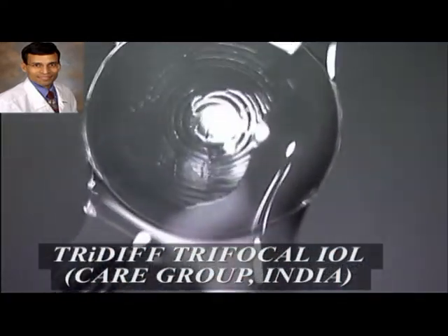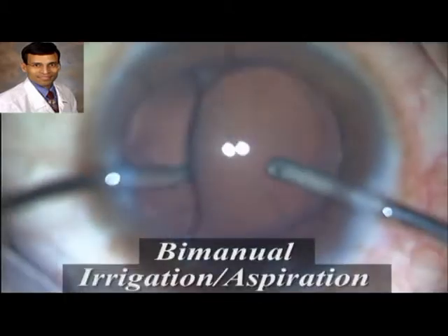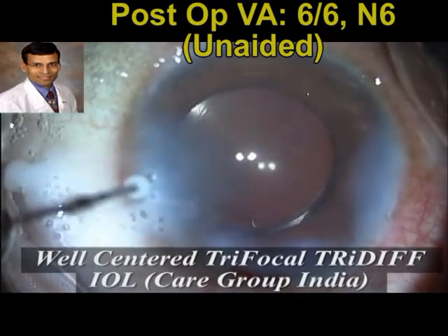The tri-diff trifocal IOL marketed by the Care Group India is implanted into the capsular bag, and here you can see the well-centered IOL with good coverage of the rexis margin over the IOL optic.